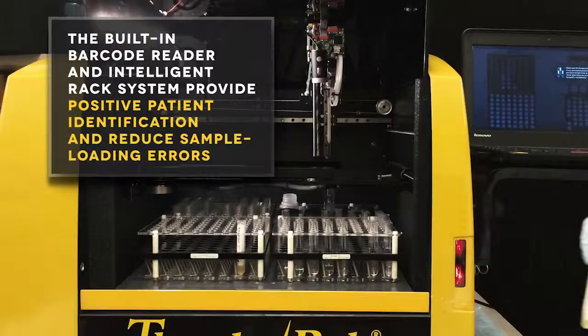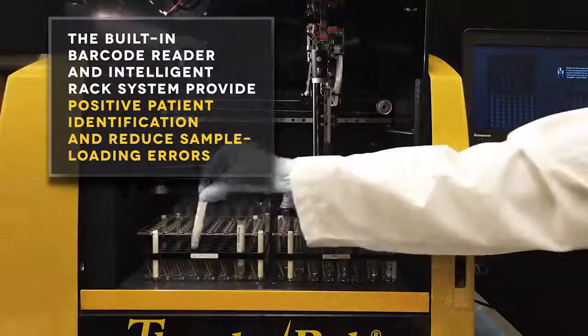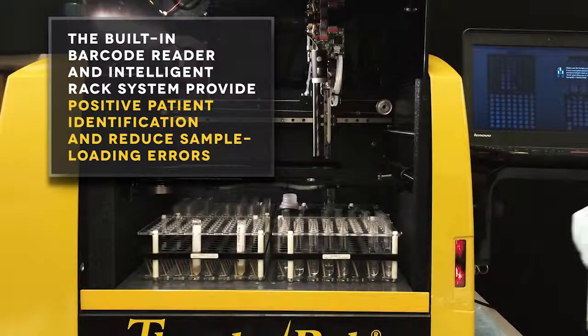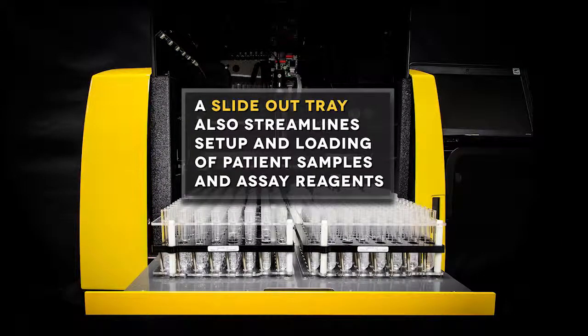The built-in barcode reader and intelligent rack system provide positive patient identification and reduce sample loading errors. A slide-out tray also streamlines setup and loading of patient samples and assay reagents.